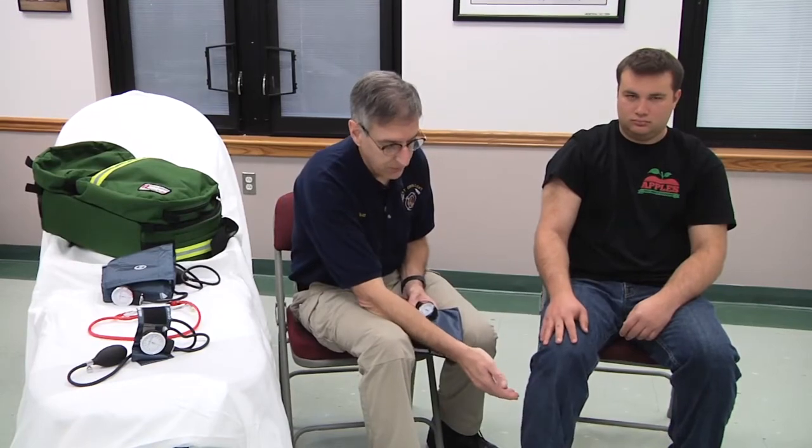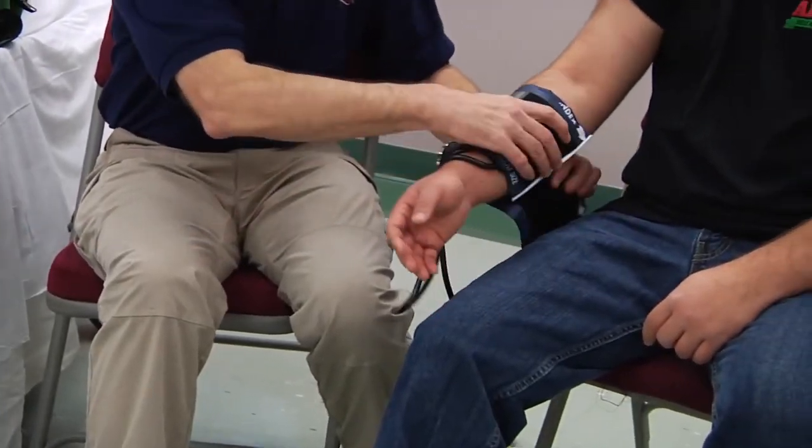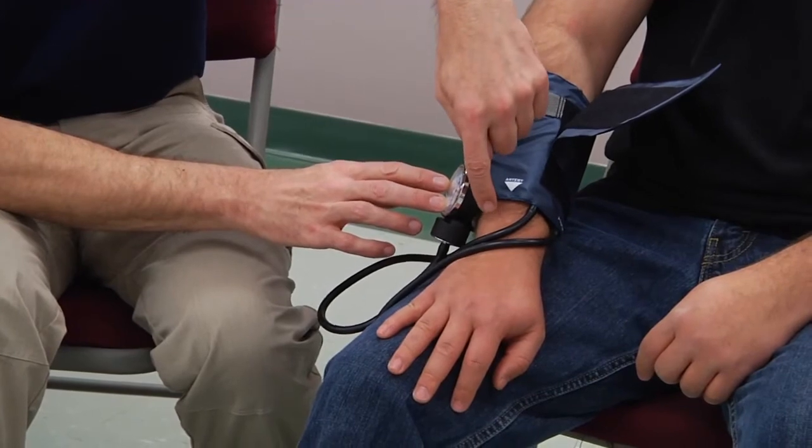In trauma patients with multiple upper extremity fractures, we may measure blood pressure in the lower leg. The cuff size is again important — if you're putting a blood pressure cuff on the lower extremity, it needs to cover two-thirds of the distance between the knee and the ankle. You could also take a blood pressure cuff on the lower part of the upper extremity, where the cuff needs to cover two-thirds of the distance between the elbow and the wrist.